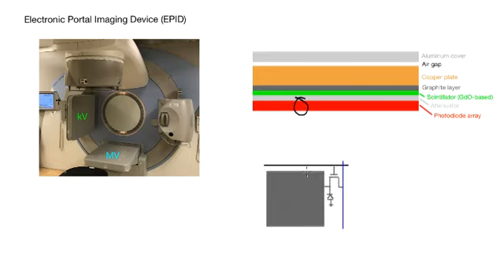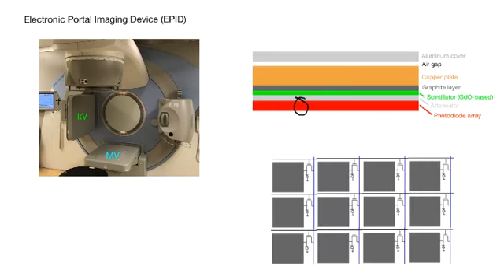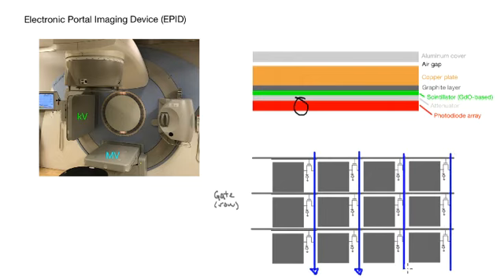So here's the instrumentation. You see there's two lines coming out, a gate line and a read line, and here's the silicon, and it's all connected to a TFT. And there are many of these, right? So I'm just showing a couple of them, but it comes in an array. They're very, very small pixels, and each are instrumented. So you have these lines going across. Those are the gate lines, or the row, and you can control which row you're reading out. And then going down, you have the readout lines. And each one of these is instrumented with electronics, and you read the data out one by one as you go along down the rows.